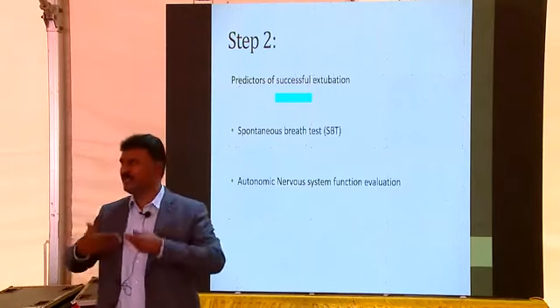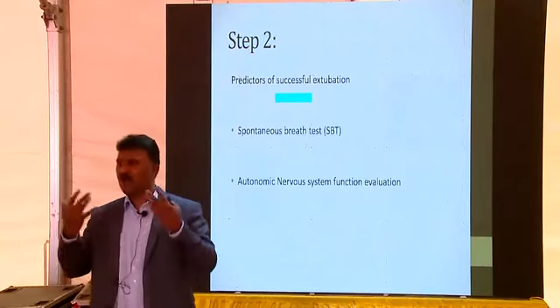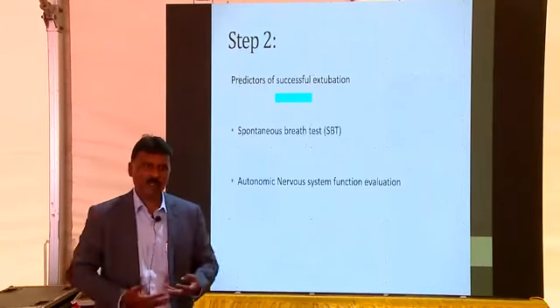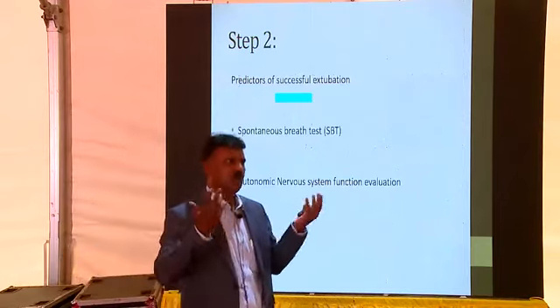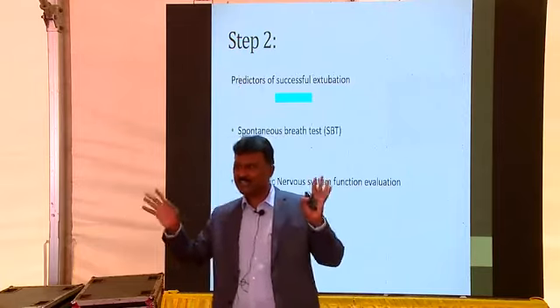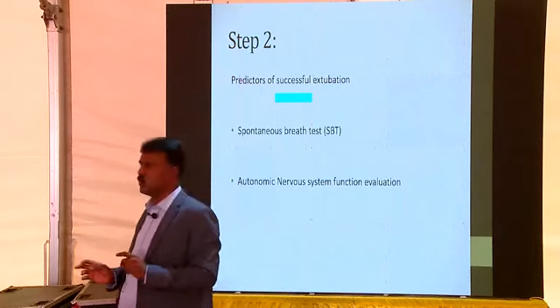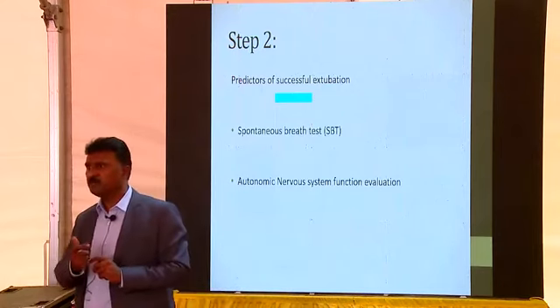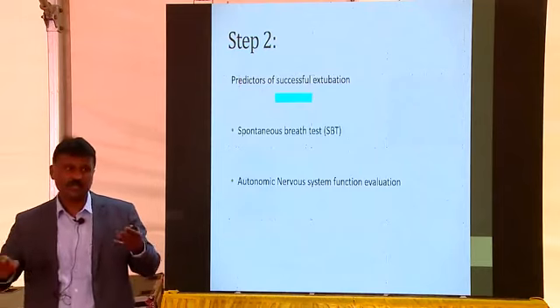The test shows whether he is able to maintain his own minute ventilation or not. If he is not able to maintain his efforts, whatever the reason he was not able to breathe, obviously saturation will drop. That's a simple test. It's a common sense test, that.